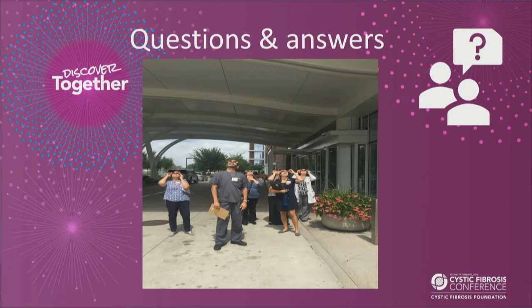Because we're using the dashboard, when the in-app coaching feature became available, we tried to do, especially early on, a lot of in-app coaching. Before that feature was available, especially with our early patients that we knew had a lot of technology, where the patient had a phone or the parent had a phone, I would FaceTime a test. We didn't have real-time results of the curve like we do with the in-app coaching, but we did have a good ability just to see the patient doing the test, which to me makes a big difference. So if we saw poor quality tests, we would definitely reach out to see if we could improve those.